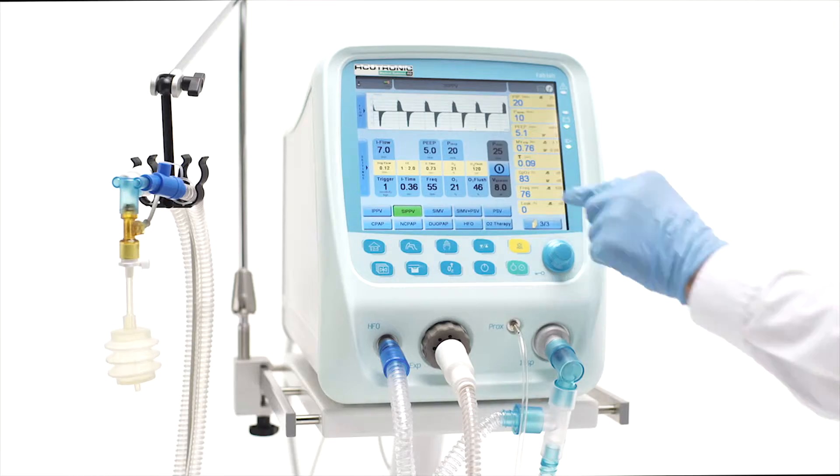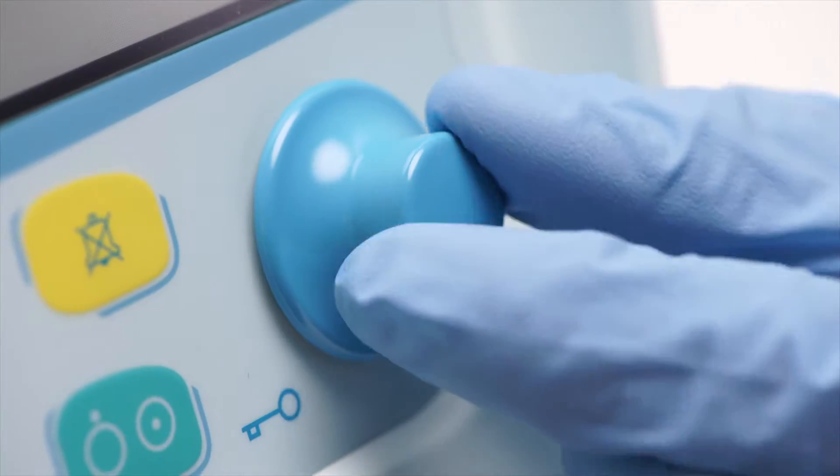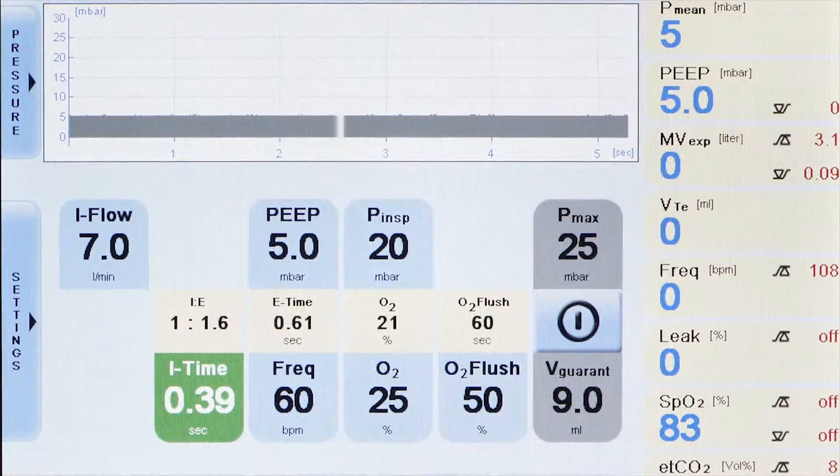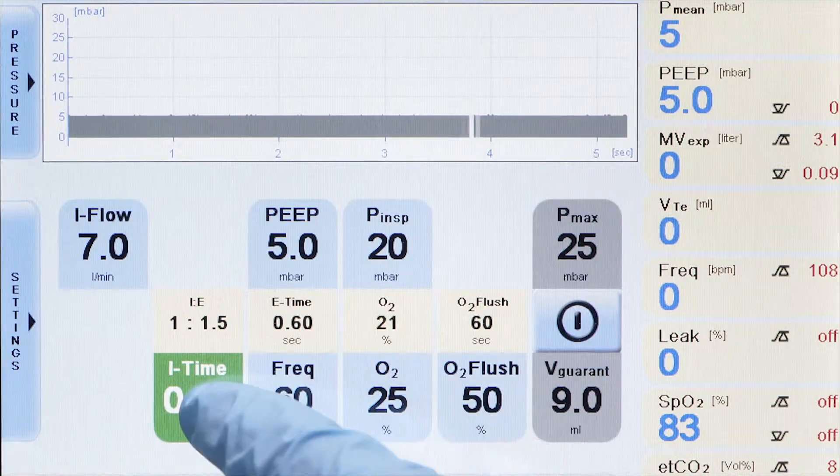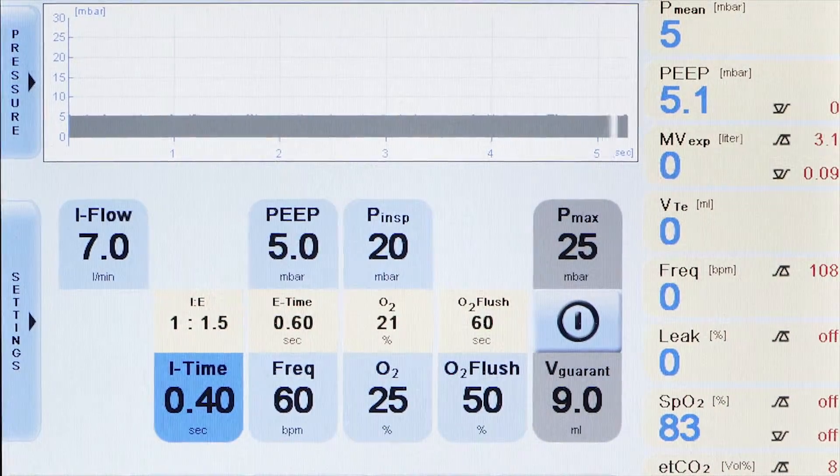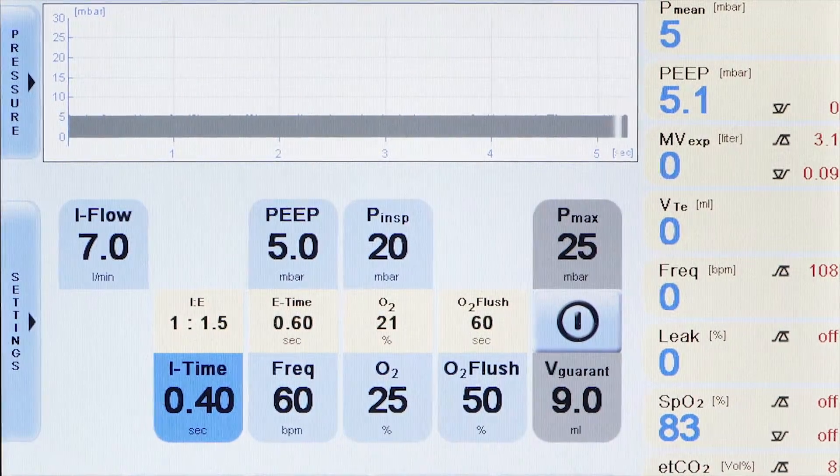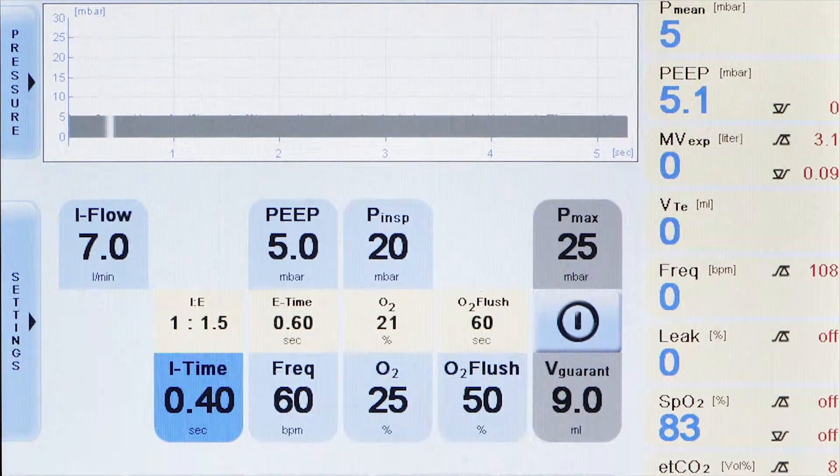I-time. Inspiratory time. This is set depending on flow waveform to achieve the optimal tidal volume with the lowest P-INSP. It is usually set between 0.3 seconds and 0.5 seconds for premature infants.